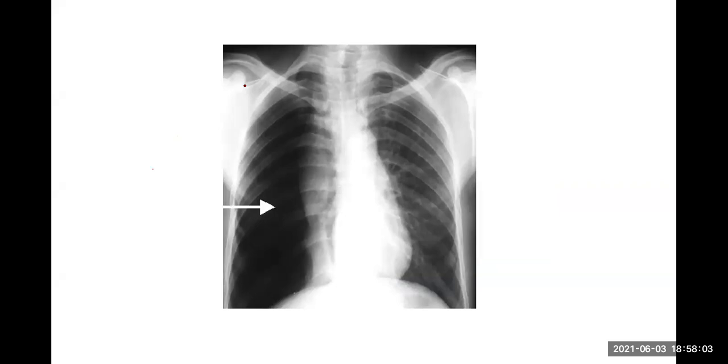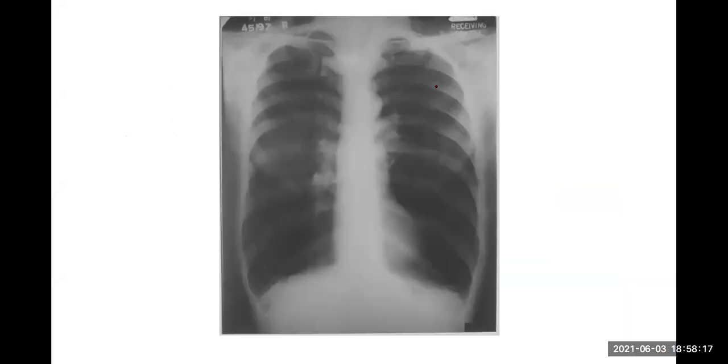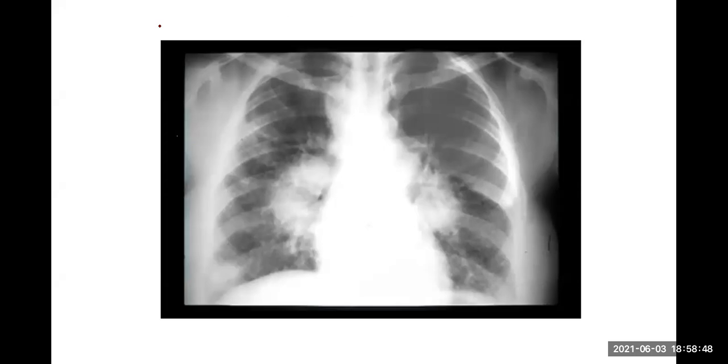Then black lesions are very easy because this is quite obvious. Air trapping and lung collapse, you can see that very nicely. Pneumothorax. So black lesion, the only thing you need to know is a pneumothorax. If there is black on both sides, this is not a very good example of it. Most likely diagnosis is emphysema. Right. And you can see on this X-ray the ribs, and that means that there is hyperinflation. Okay, right. This is not very important.